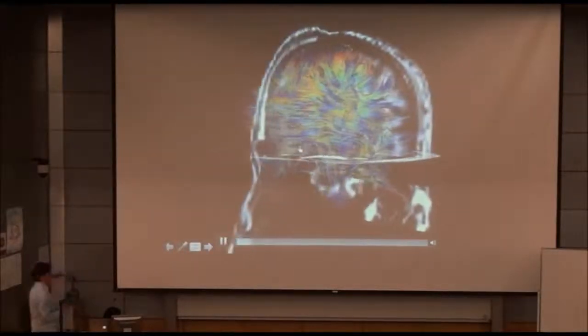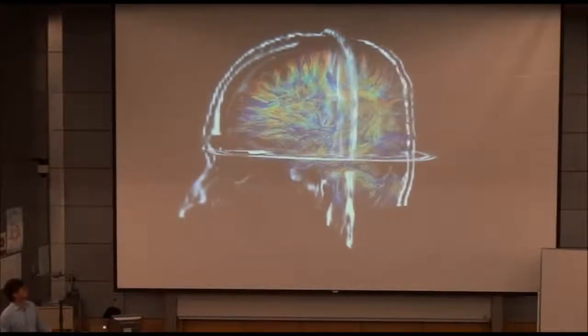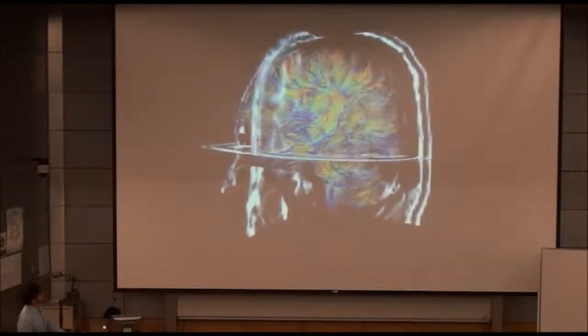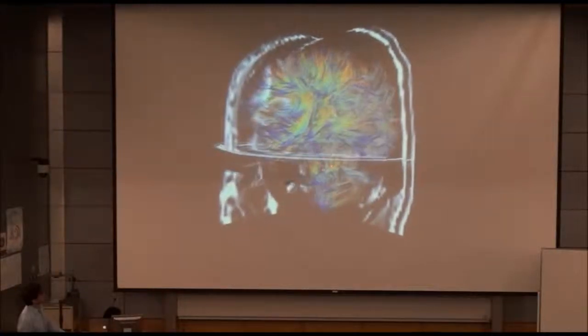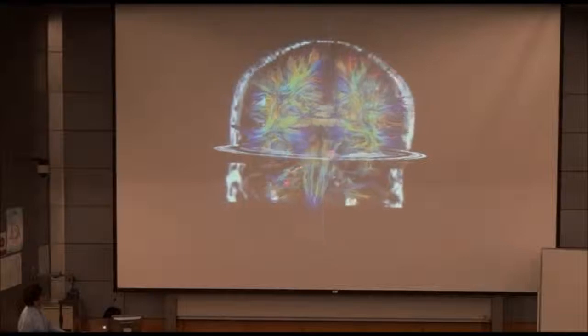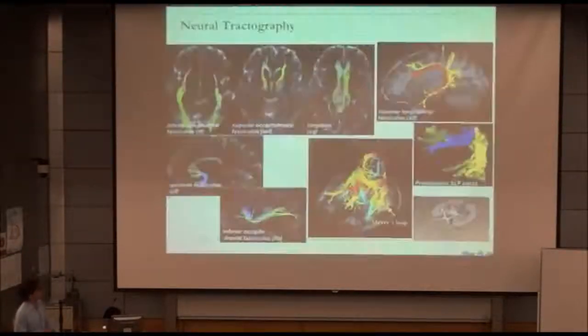You can see, based on these techniques, we can identify the brain fibers and structures non-invasively, and even see some more detail. For example, the tracks from spinal cord to cerebellum, and to identify some specific tracks we need the brain.